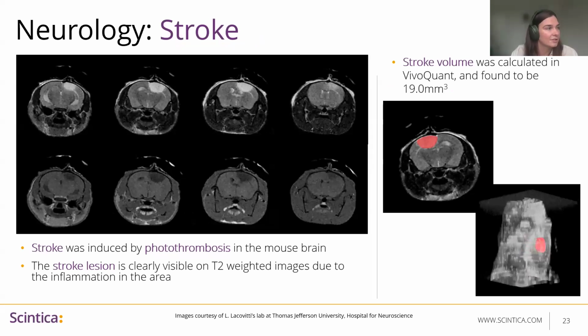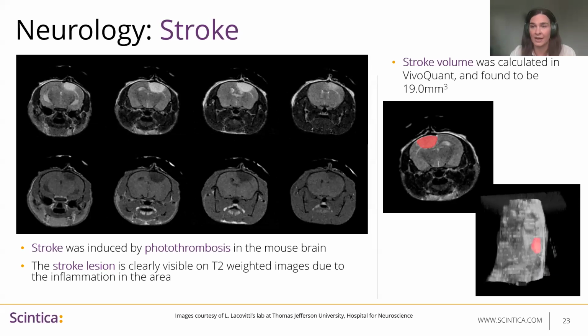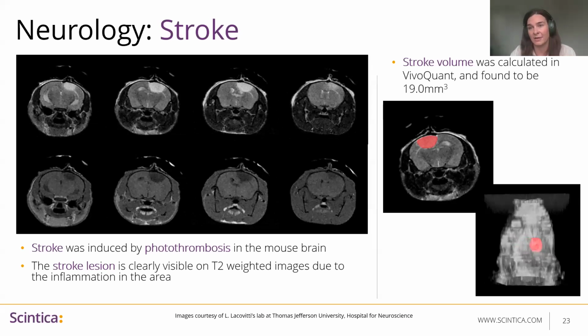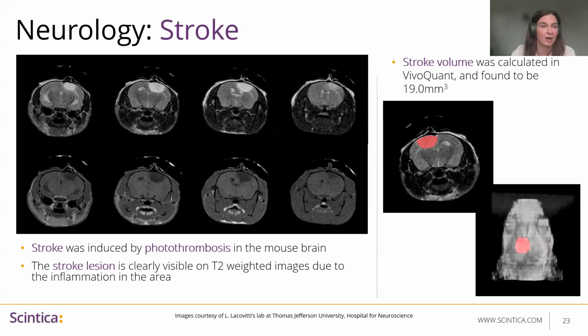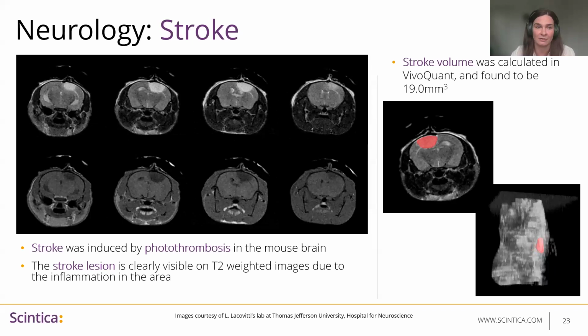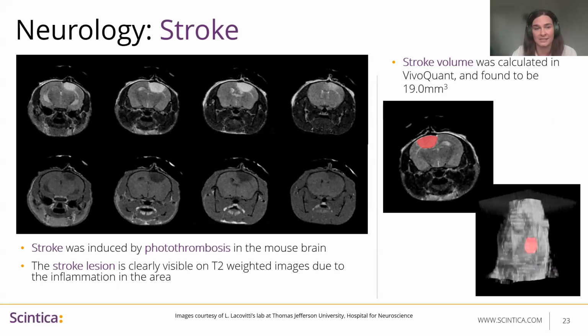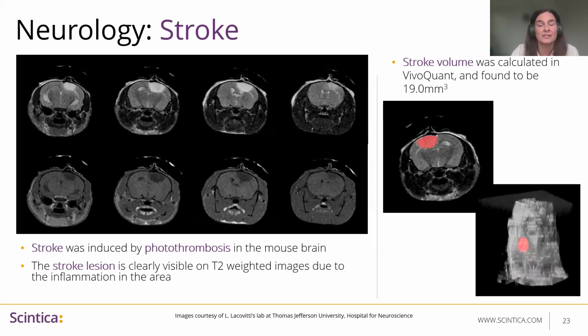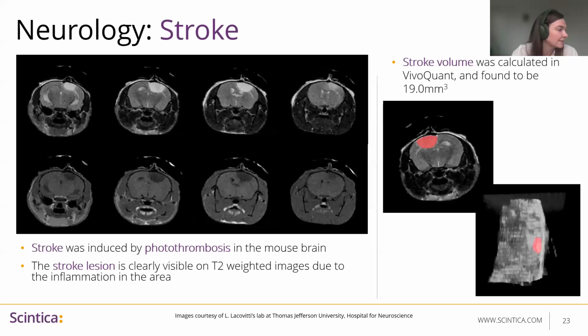And then we're able to look at both T1 and T2 images. So the T1 is shown on the bottom, your T2 is shown on the top. So that bright area shows the lesion and is oftentimes indicative of inflammation. On the T1, on the lower panel, we're able to see those dark areas, which can help differentiate areas like edema versus hemorrhage versus dead tissue. So again, utilizing multiple sequences can really help differentiate and understand those underlying tissue characteristics.